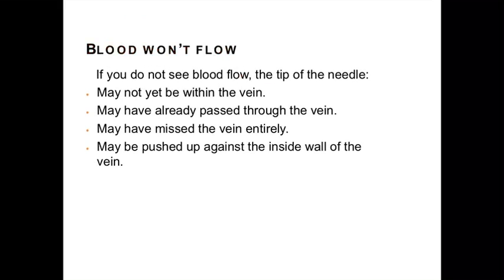Sometimes the blood won't flow in from the needle. There are various reasons for it. The tip of the needle may not yet be within the vein, may have already passed through the vein, may have missed the vein entirely, or may be pushed up against the inside wall of the vein.